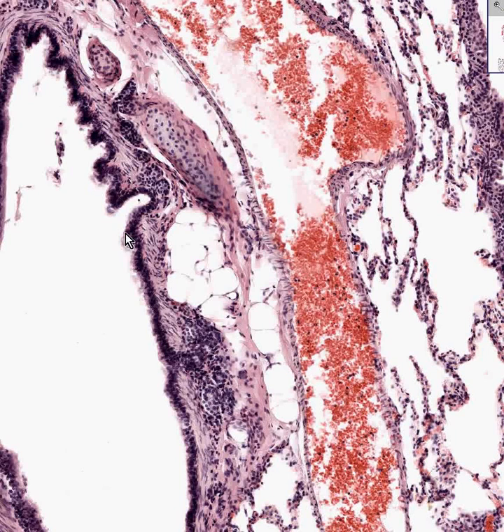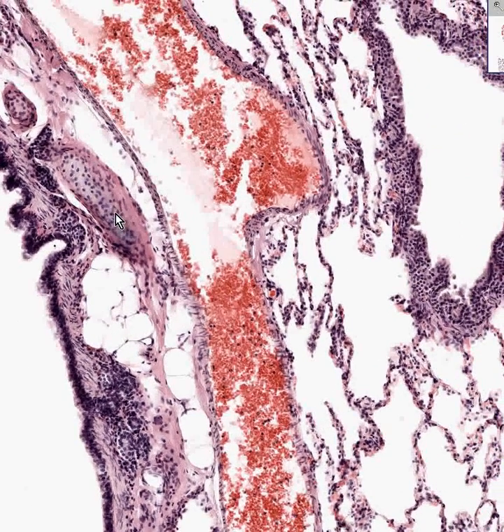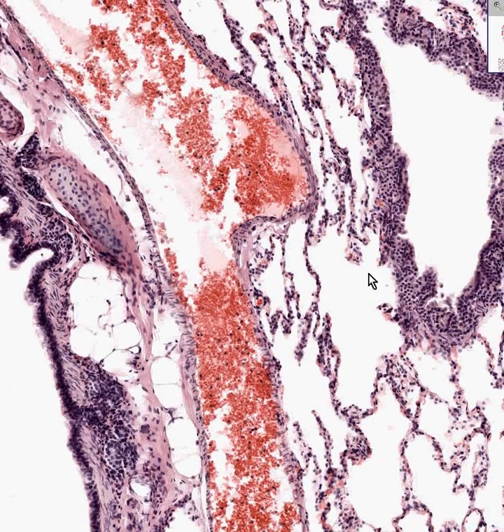Here is its normal columnar ciliated epithelium. Here is the lamina propria. This fat can be regarded as submucosa. I believe you can call the cartilage as actually being in the adventitia. I don't think you could think of the trachea or bronchi as having an actual media.